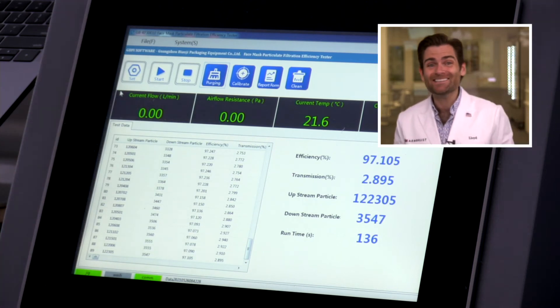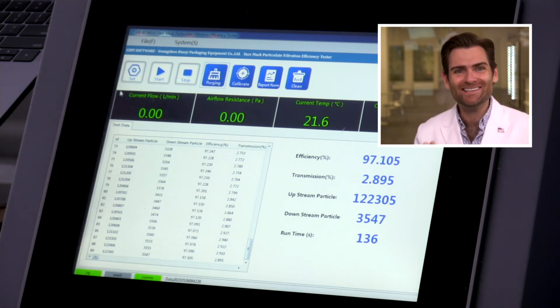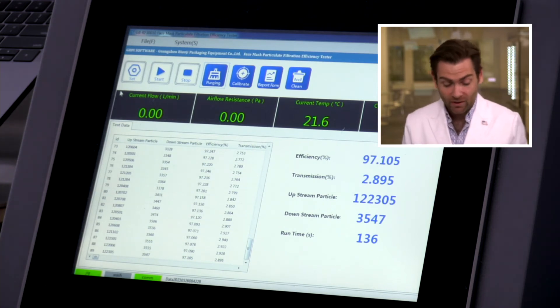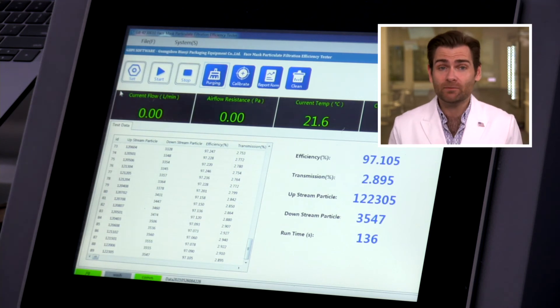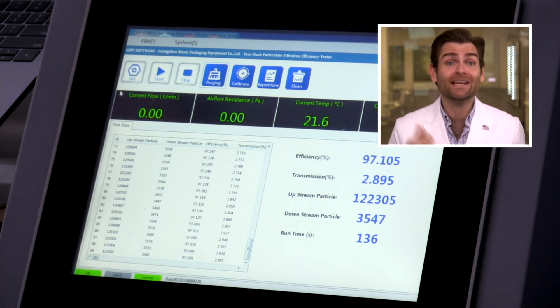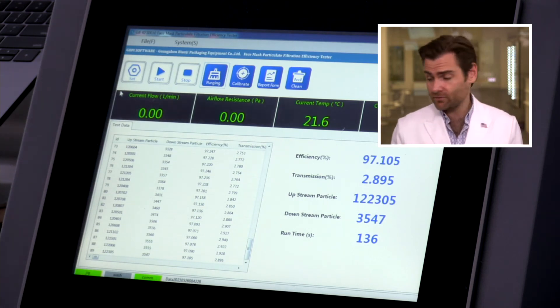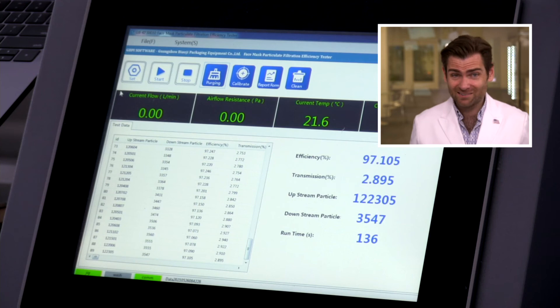Nice — 97.105%. That's a great mask. Now they actually make an ASTM level three mask that you can get on their website, and that's going to be 98% or better. This one is their lower level mask, which is 95% or better, but this is a great mask. Good job, guys — very proud of you. I like the product, I like the team, I would wear this mask, I trust these guys. The ear loops are just delightful, though don't pull them too hard — if you are a fat bald eagle, it won't work. Thank you guys for watching and I will catch you on the next test.